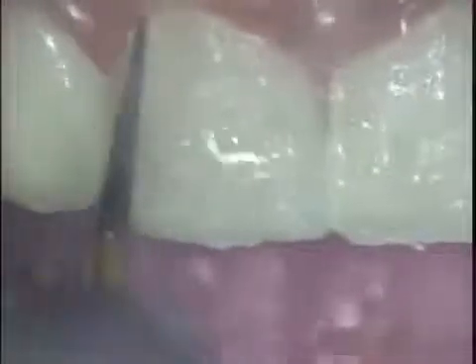Now that the midline diastema has been closed, the composite can now be finished and smoothed and polished using a series of carbide burrs, small diamonds, and composite polishing discs. The final facial surface is then polished using silicone cups, and the case complete.